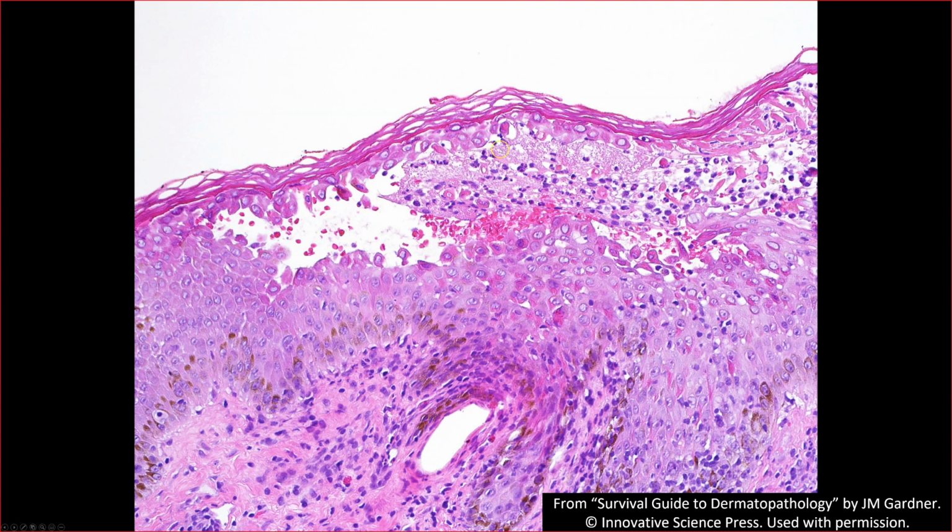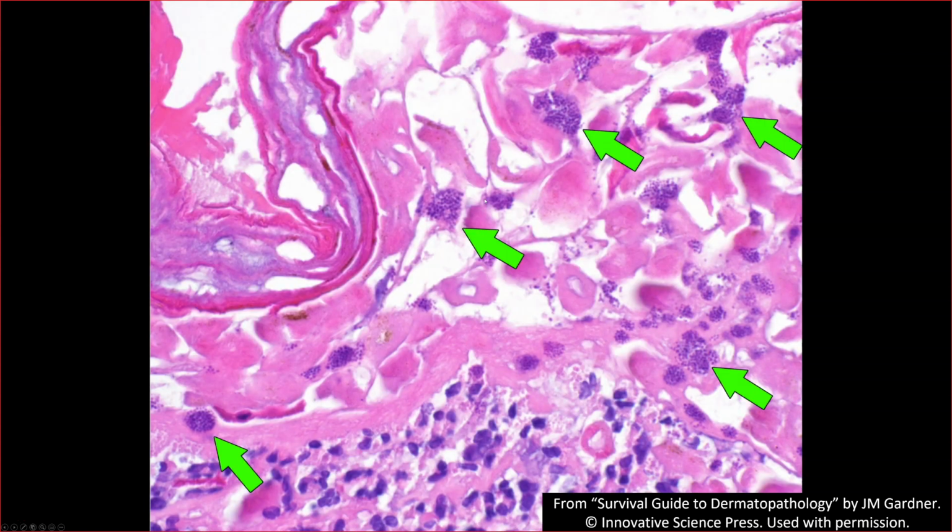And look what we see here, tons of little dots in the blister cavity and neutrophils. So that's bullous impetigo, and there's a closer look. Again, dead, rounded up acantholytic keratinocytes here, bacterial colonies, and neutrophilic infiltrate down there, bullous impetigo.